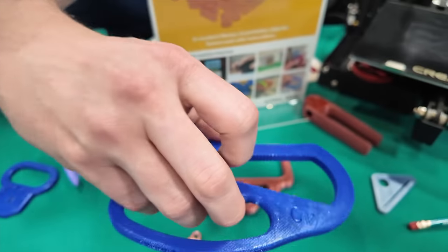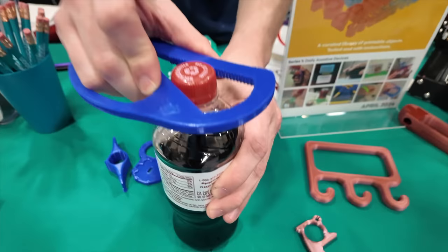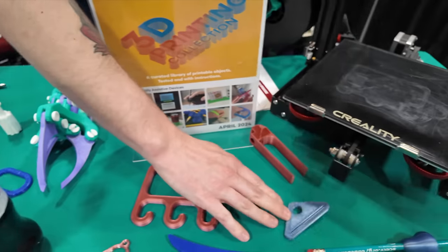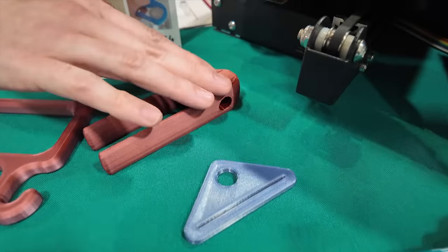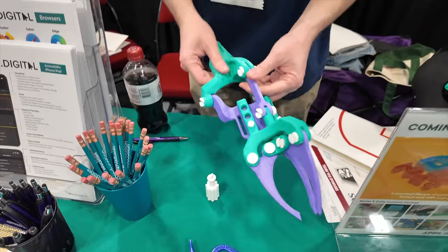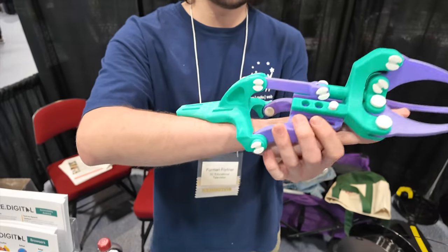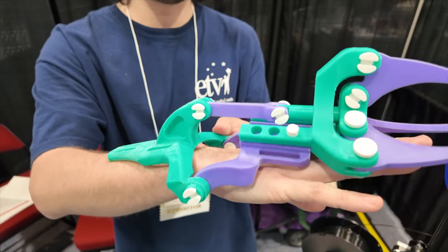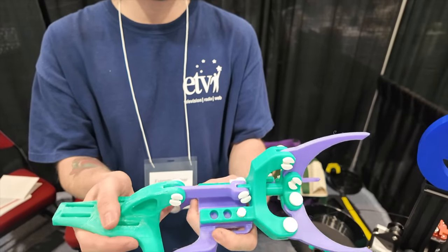This helps open bottles. So if I wanted to open the bottle up, I can use this to help if I didn't have the grip strength. Toothpaste squeezer and then different kinds of pencil and utensil holders. And then this is an assistive arm that would mount onto your arm like this. So this would mount to your hand and this part would mount to your wrist. And when you flexed your wrist, it would engage the claw like that.